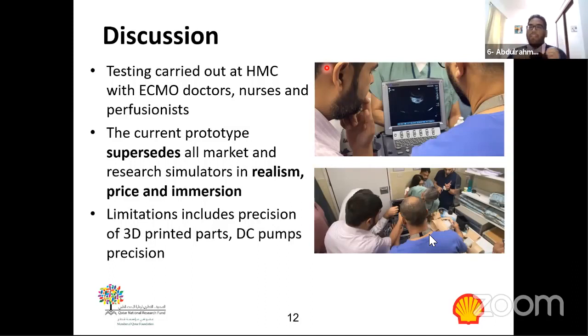But unlike us, we have an actual cannulation access point, so the trainees can cannulate the system. As you can see in the pictures, the ultrasound is already running and there is cannulation. So it's a bit different. We actually included them in our literature review and the report if you would like to see that. But as I said, our project is more intensive and it actually includes cannulation, unlike theirs.